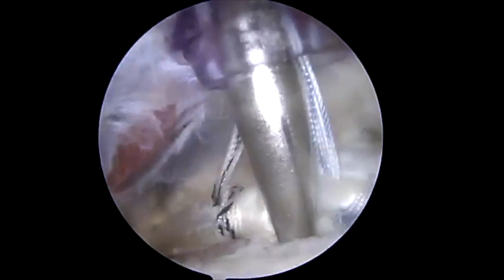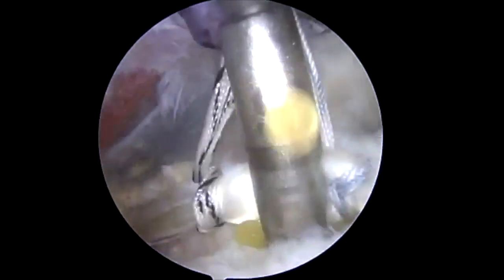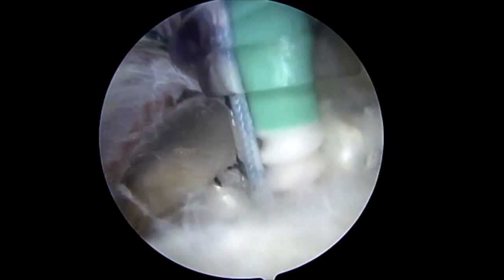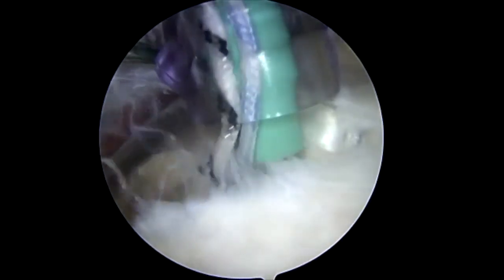The sutures are then affixed between each other in the proximal bicipital groove using a 4.75 knotless all-suture composite anchor. The bone is punched and tapped as needed for hard bone. The anchor is inserted with the sutures held under gentle tension, and the suture tails are then cut.